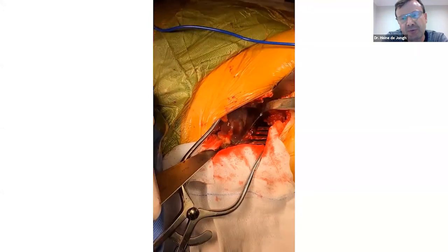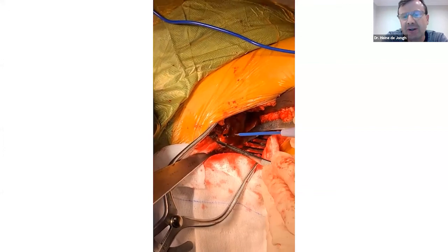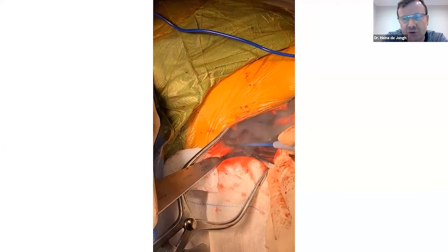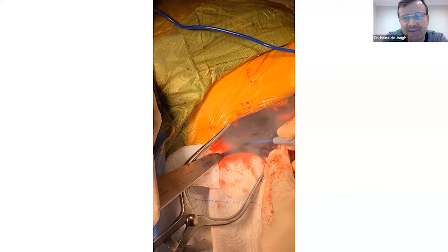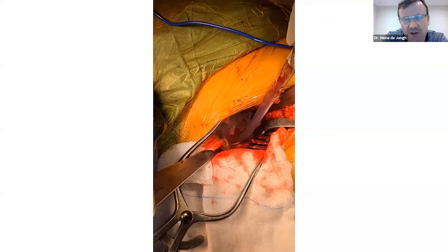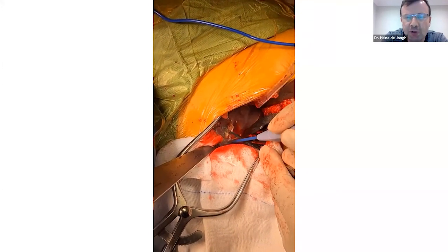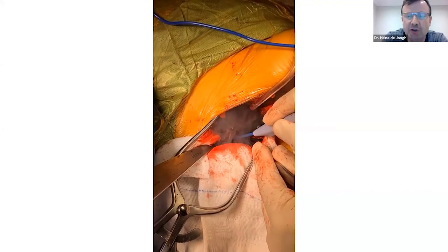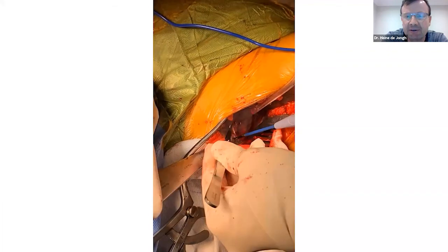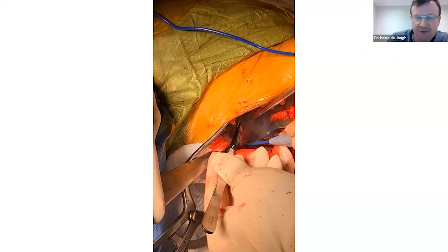It's resting on the femur distally and approximately just on the anterior tissue. If you have difficulty getting access, the first thing I do is look at my femur neck, and maybe it was cut too long. The second thing, and most guys, I know Koos and the guys talk about this at the routine, is to do your femoral preparation before you start with your acetabular work.